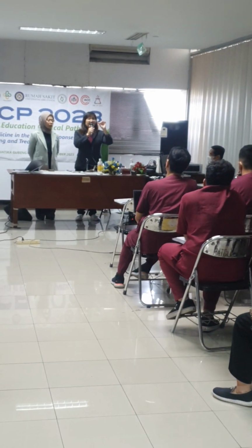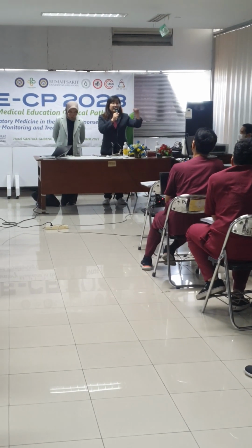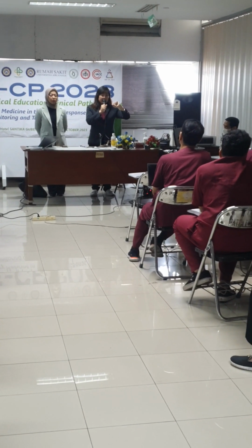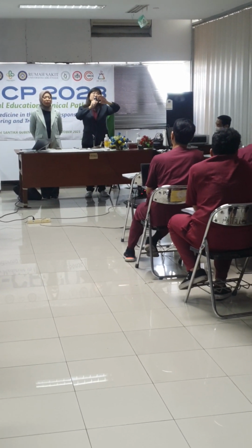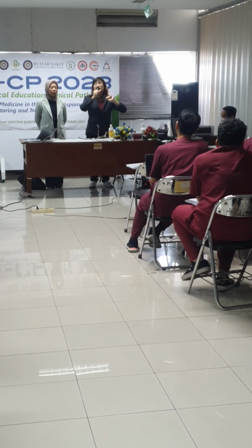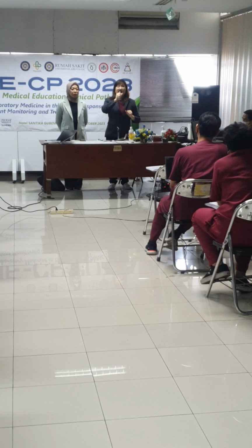Okay, how about the sample from amniotic fluid? This test, with amniotic fluid, we don't have it under IVD, because for IVD we must justify our intended use for that sample type. Our intended use has been for babies less than 21 days, from urine or saliva swab. If you want to use it for amniotic fluid, we can use it as an open platform. But before you use it on an open platform, you have to do studies to prove this is the process and this is the correct result. That is something you have to bear in mind as well.